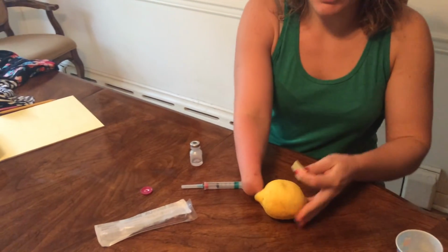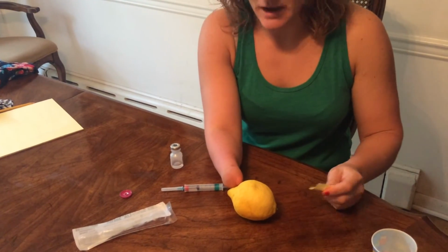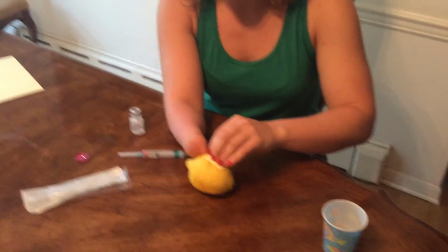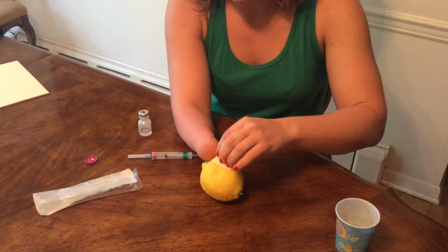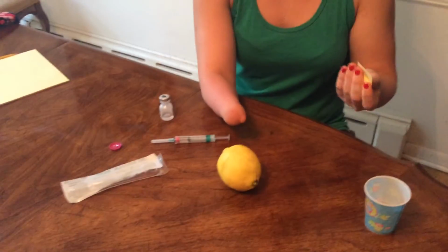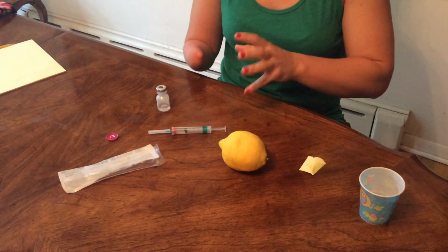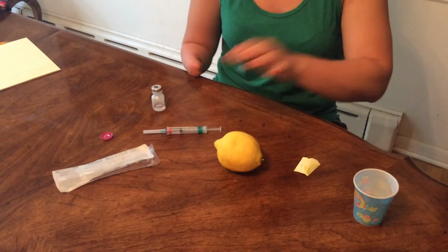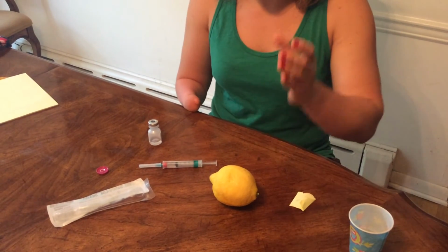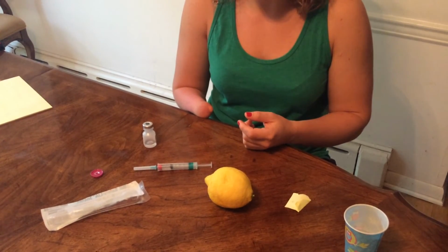The next thing you do, we're going to pretend this lemon is the patient. Obviously I was not going to inject someone without needing to, so get their skin all nice and ready. A lot of times they say circular. That's what they practice in nursing school, but really you're going to be scrubbing the area to make sure it's clean. You don't want to inject them right away either. You kind of want to give it about 20 seconds just to have the alcohol dry, because if you are injecting them right when you have that alcohol wet, then the alcohol is going into the skin and then it burns the patient, so you don't want that.